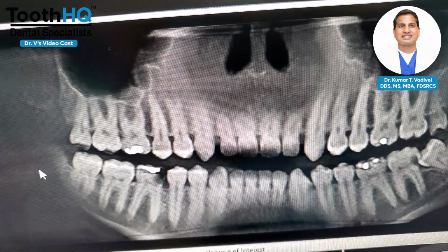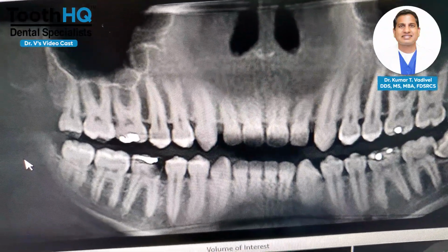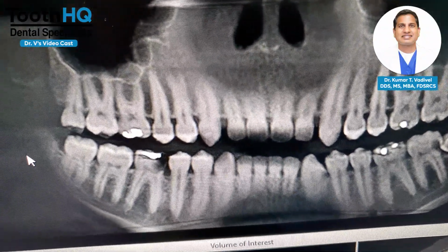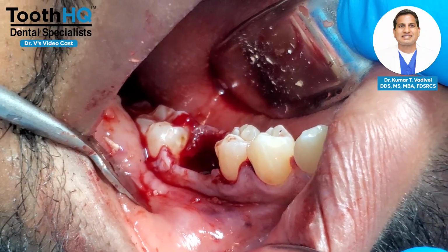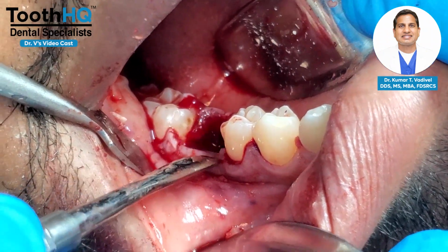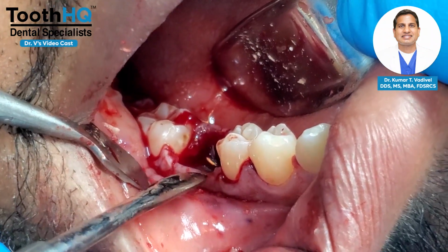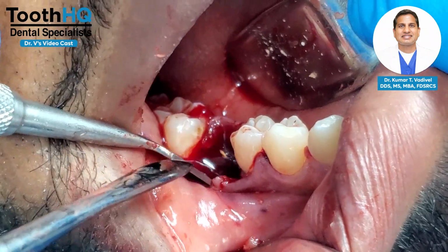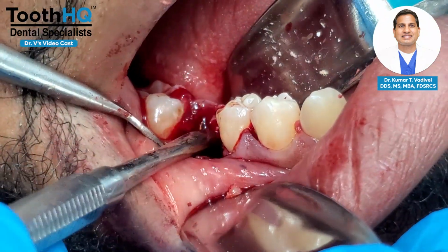So this is the x-ray. The tooth has already been extracted, so I'm going to go into the mouth to show you exactly how to do the socket preservation. So the goal is to do an atraumatic extraction. So number 30 is extracted, but you can see the flap is all the way up right here, and the totally atraumatic extraction. I don't know whether you can see the bone very clearly or not here.